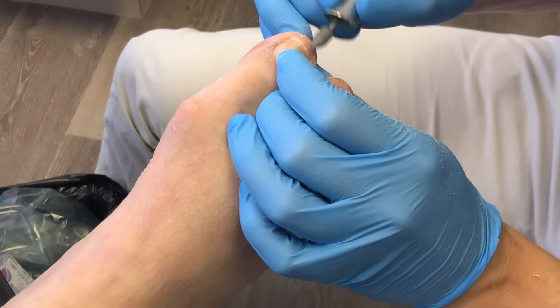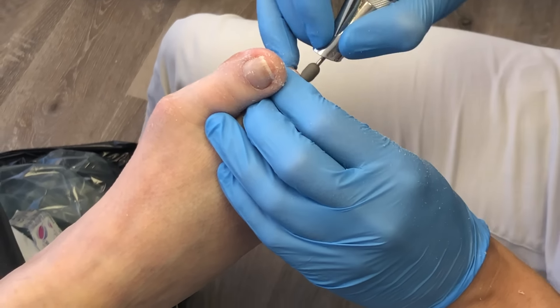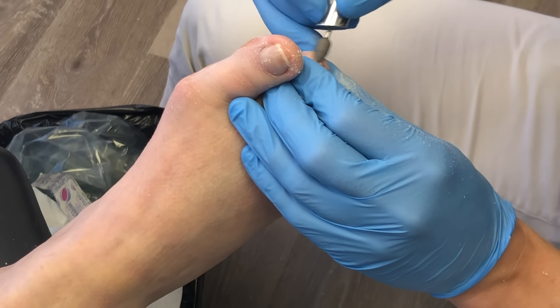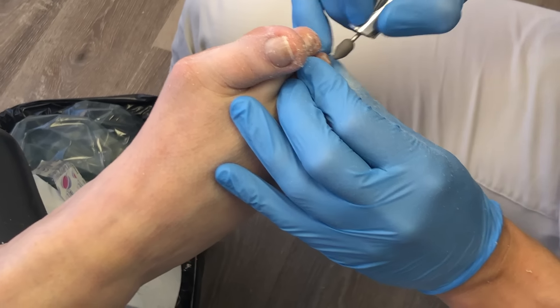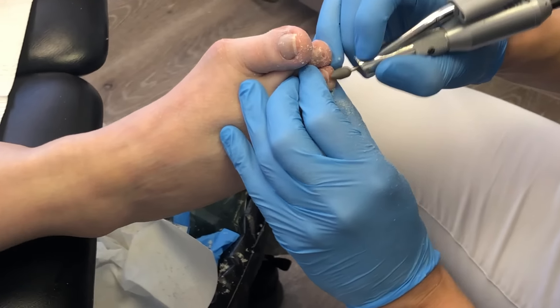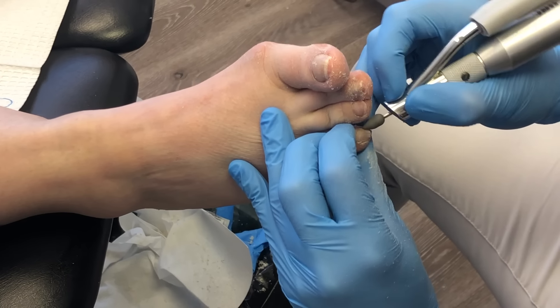The burr is a great finishing tool. You can see how I'll use it against the skin to make sure it's nice and smooth, and you can see how much tissue it actually takes off. That will feel a lot better for the patient. Here's the second toe — I'm smoothing that nail out so there's not so much pressure, and you'll see that millimeter of growth there as well.